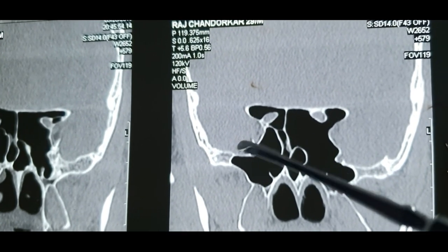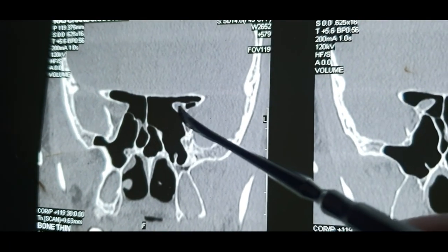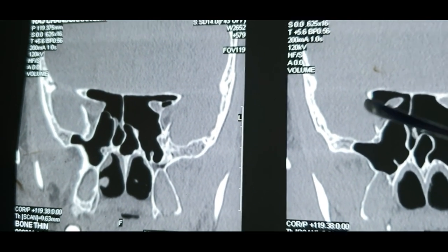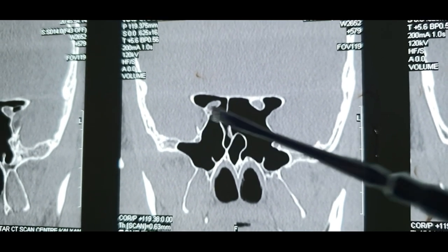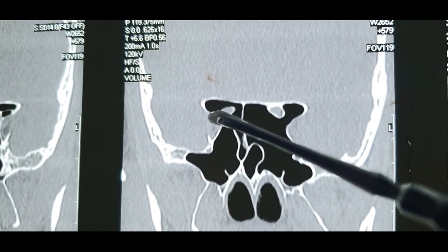Now, as I said, this was the area of the cavernous sinus. Keep following the orbital apex, you end up in the superior orbital fissure, and directly posterior to the superior orbital fissure is nothing but the cavernous sinus. This is the cavernous sinus. If you do an MRI with contrast, exactly at this level you will see the cavernous sinus. And I will show you this area.